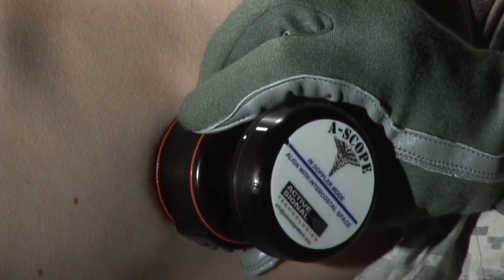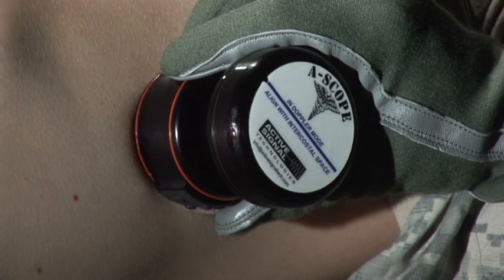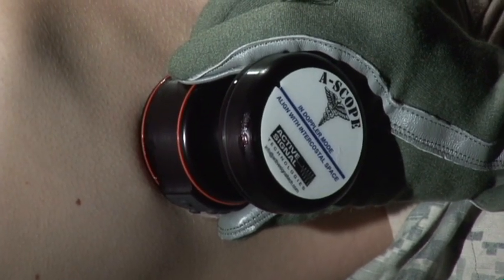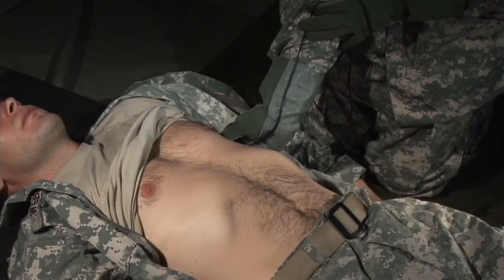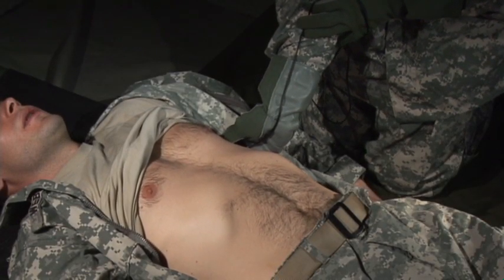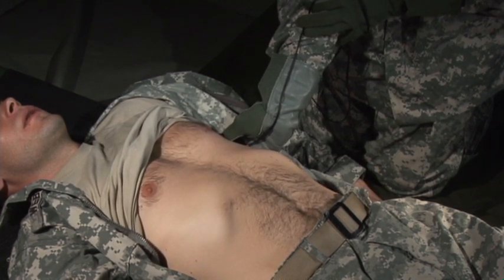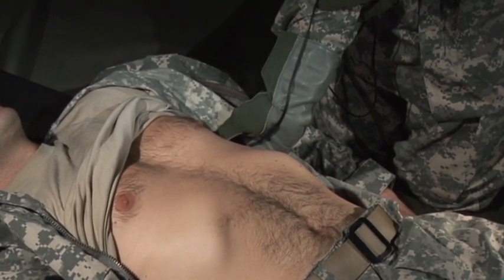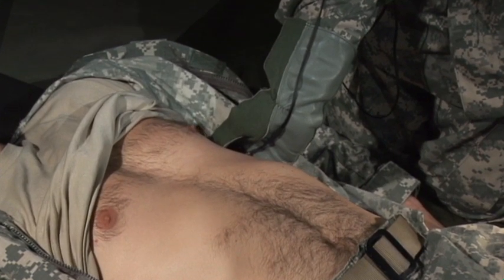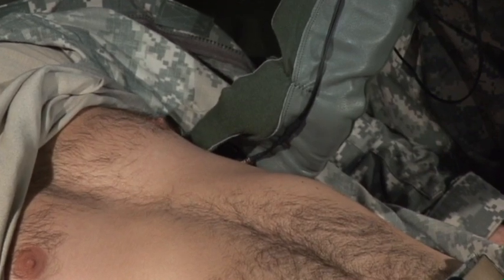As you start using the device, lung returns will probably be more difficult to discern compared to heart returns. The low frequency and soft tone of the moving lung can be mistaken for the noise of the stethoscope face sliding across the skin. Bear in mind that Doppler returns from the lungs can only be detected with deep inspiration and expiration. This is the same as for a conventional stethoscope where significant air movement must be produced to generate audible lung sounds.